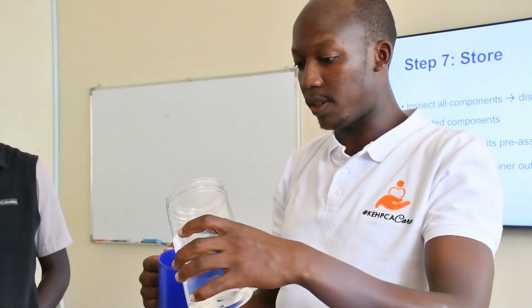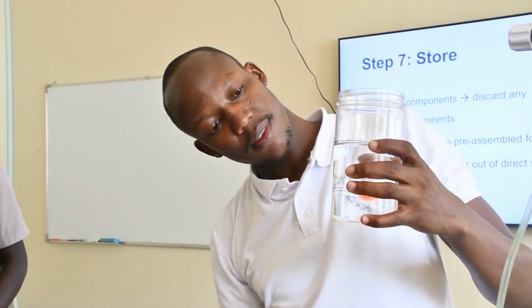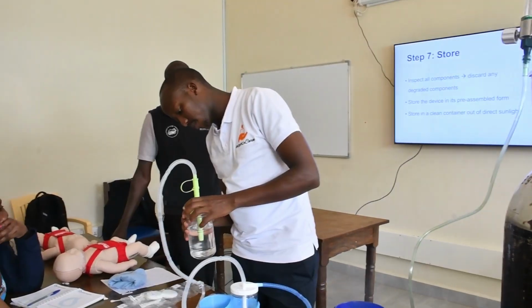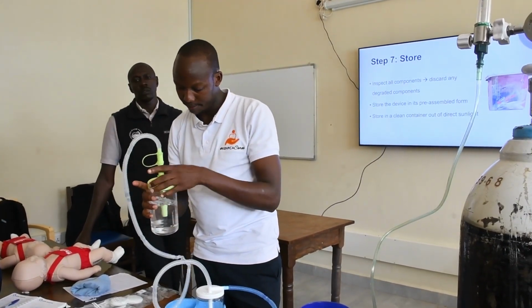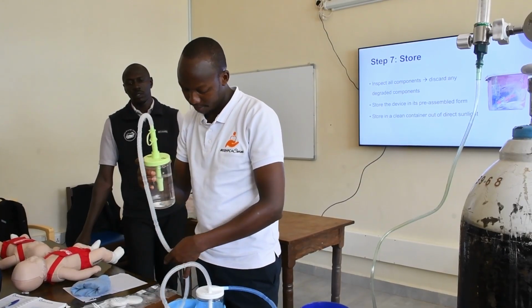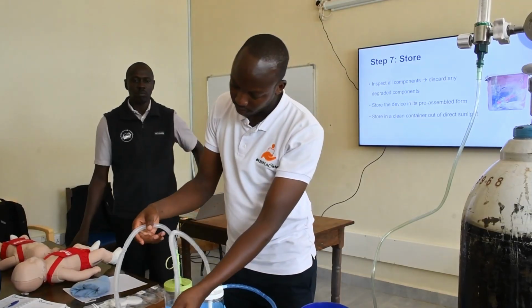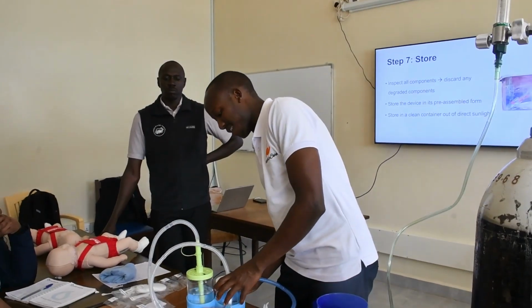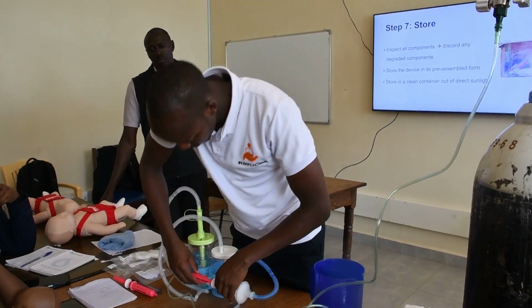These are distilled water. So that's water. Close it tightly. Before you connect it to your patient, ensure that everything is closed and well fitting.